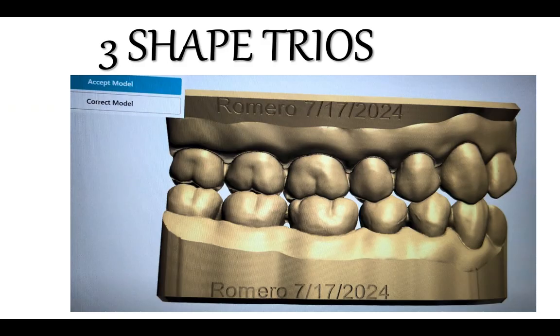Another system that is also open is the 3Shape Trios. You're going to have this one in your clinics. In each clinic, 3A, 3B, 2A, 2B, you have two laptops, one for PlanMeca and another one for Trios. The Digital Dentistry on the third floor is just for 3Shape, and the Aesthetic Clinic is only going to have PlanMeca.